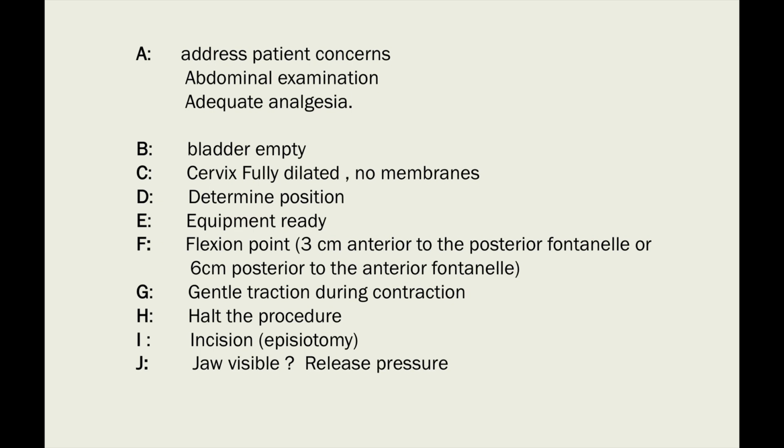So for example, if she's under epidural, I have to confirm that the epidural is working well, and if she's not under epidural, we may need to do some infiltration like a pudendal nerve block, or just infiltrate the perineum with a local lignocaine or anything like that. So we need to be sure that the patient is fully comfortable.